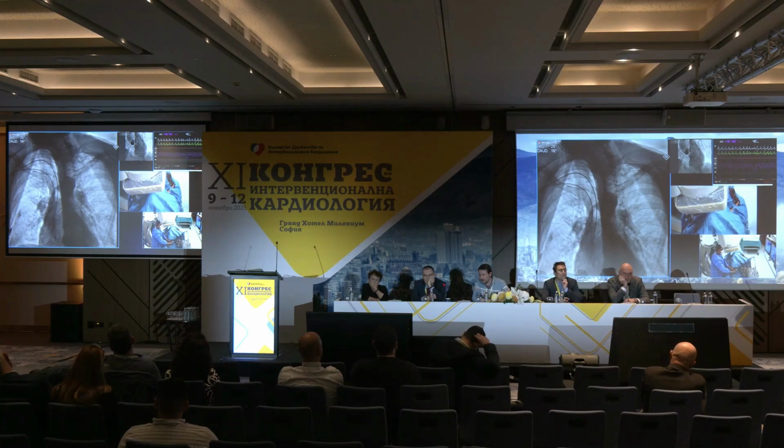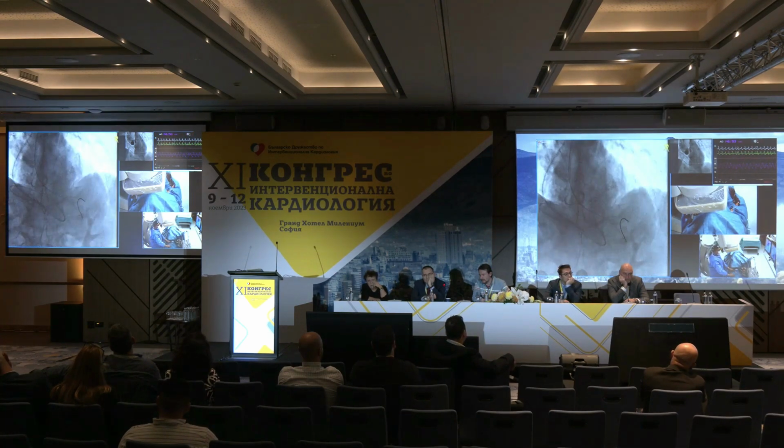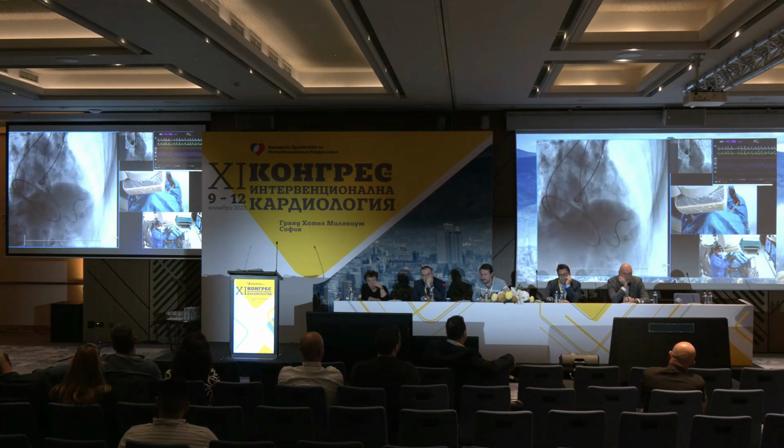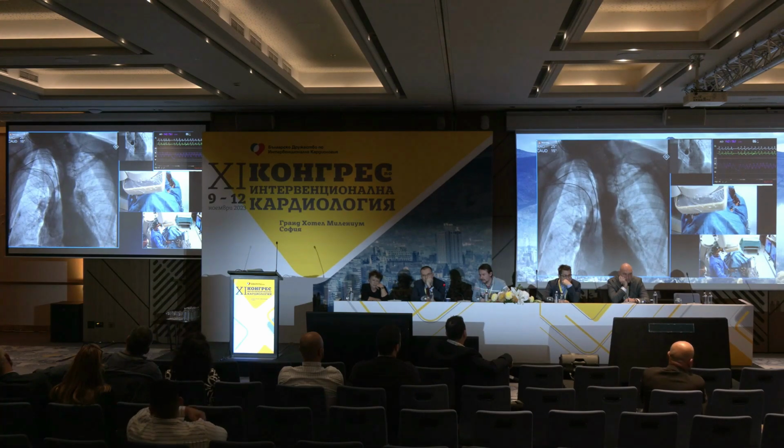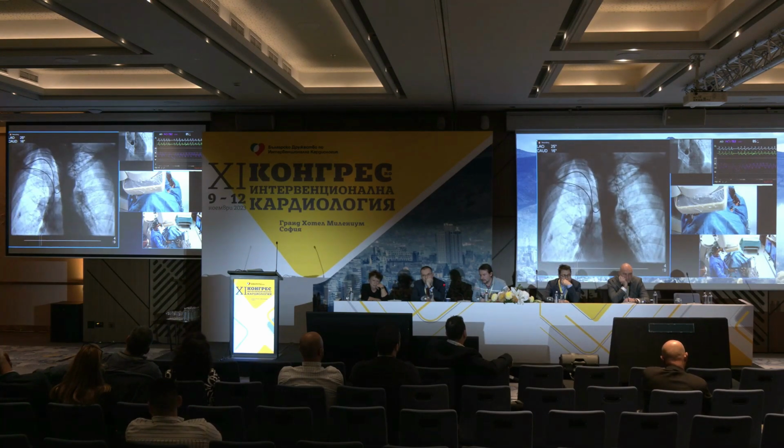And we have measured the subclavian and the axillary artery, and because we are going to implant a 26 valve, the subclavian is big enough to accommodate the delivery system. Let's go next. So this is the position of the pigtail, and this is the position again. You see, this is the opacification of the left axillary artery.